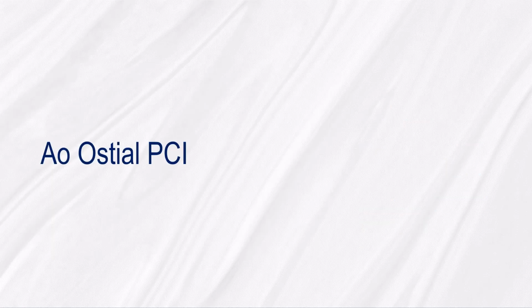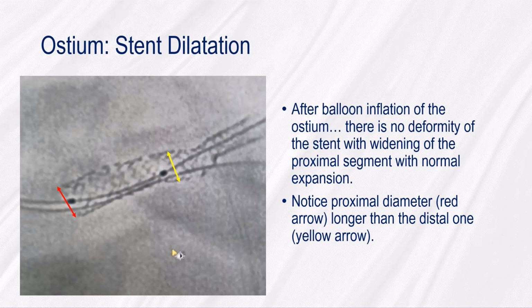Regarding aorto-ostial PCI, stent dilatation can be seen in the enhancement images. After balloon inflation of the ostium, there is no deformity of the stent, with widening of the proximal segment with normal expansion. Notice the proximal diameter, red arrow, is longer than the distal one, yellow arrow.